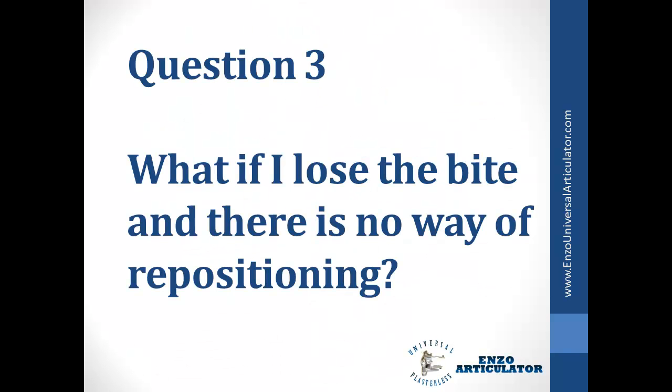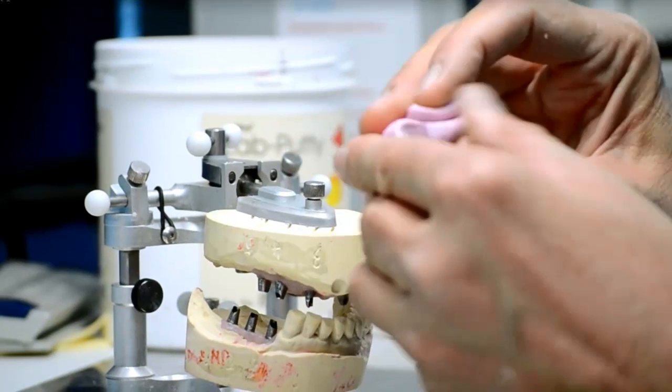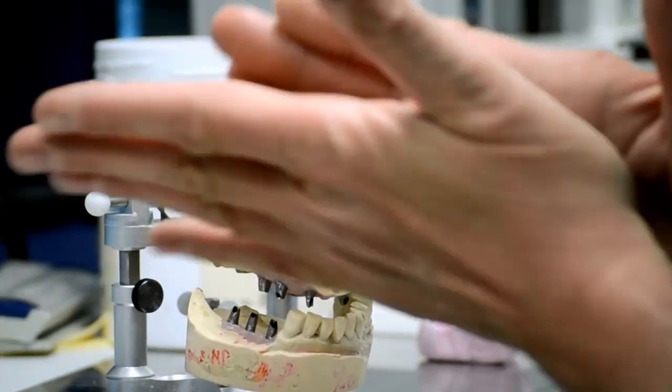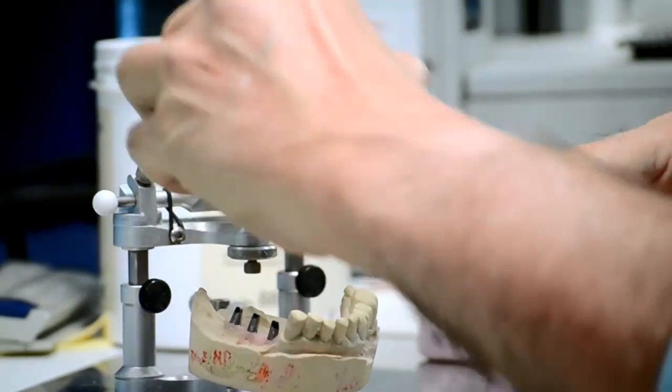What if I lose the bite and there is no way of repositioning? After you articulate your case, for safety, mix some lab putty and take a bite so you have an index to go back to.